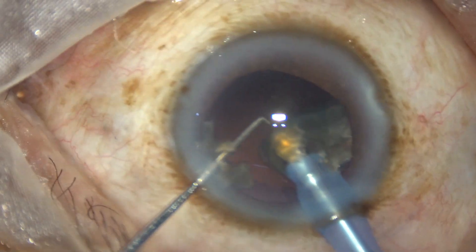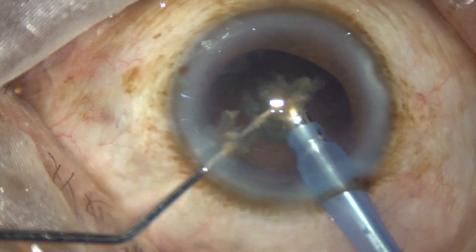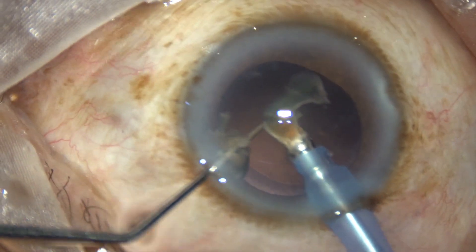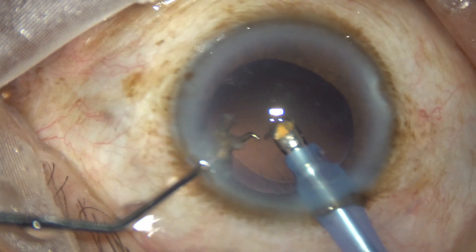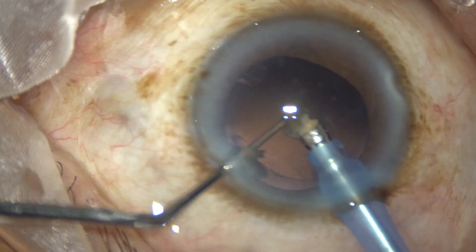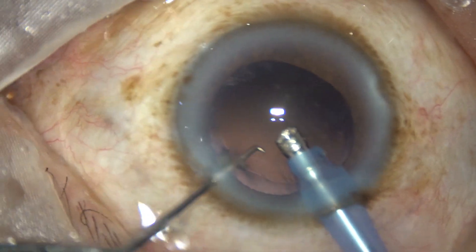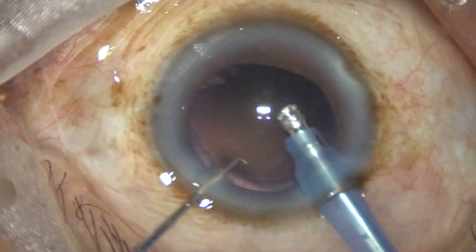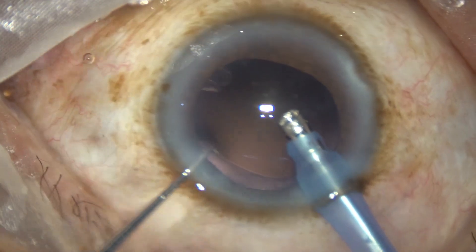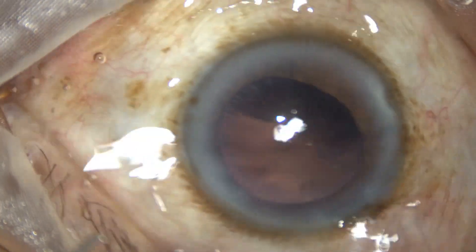During emulsification of the last bit of the nucleus, we reduce the vacuum to about 300 mmHg, flow rate to about 30 ml per minute, and ultrasonic energy is reduced to about 70 percent. Very slowly and carefully we manage the nucleus. The small bits of nucleus are emulsified and very small fragments come out through the side port, and thus we manage the nucleus.